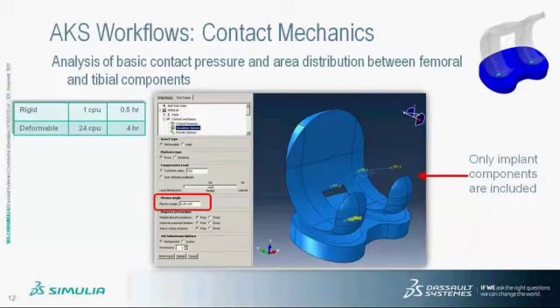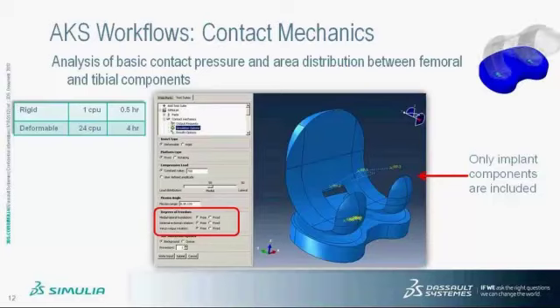So in this case, the femur component will start from 0 degree flexion and go to 120 degree flexion, and the user will be able to visualize the results at 30, 60, 90, and 120 degree flexion. As the compressive load is applied on the femur component, the other degrees of freedom for the femur component can be either left free or be fixed.